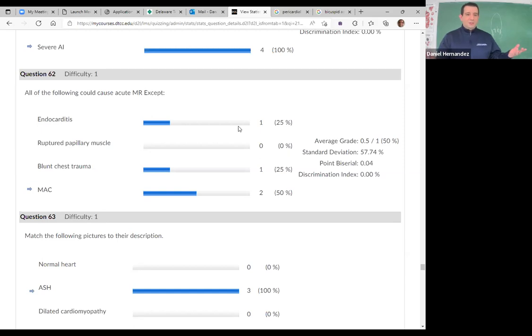The patient all of a sudden develops an infection on that valve and a vegetation, and that vegetation will typically cause mitral regurg. That's one thing to remember about endocarditis versus a papillary fibroelastoma: vegetations or endocarditis will typically have regurgitation associated with it, while the papillary fibroelastoma does not.